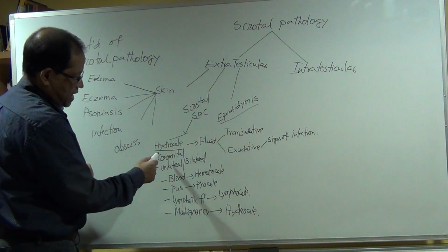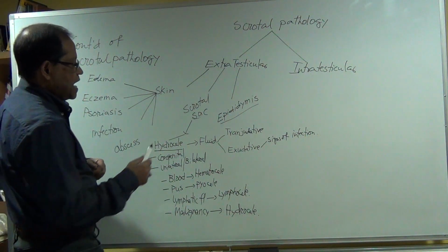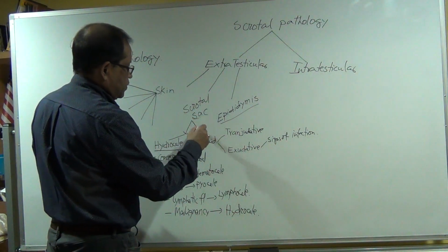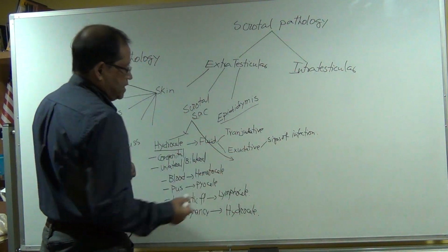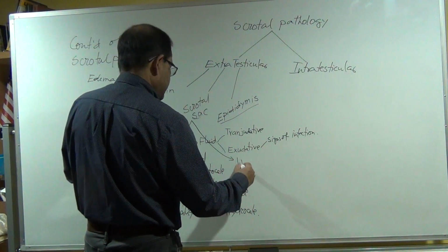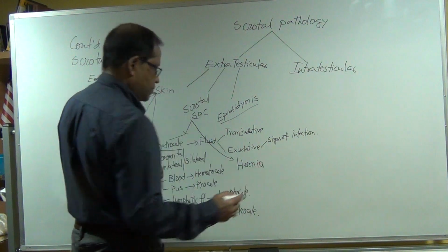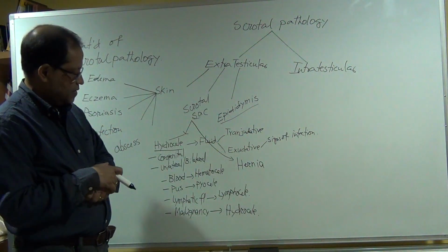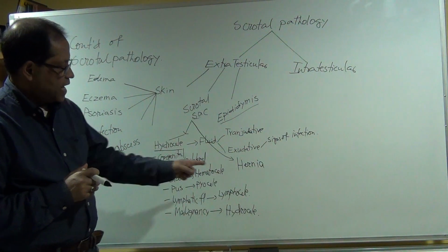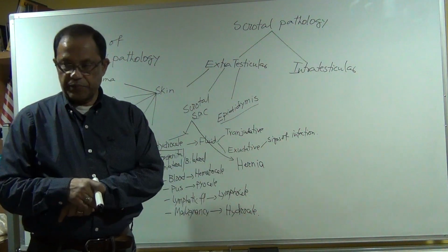Okay, in the scrotal sac, one can be hydrocele and the other, look here, would be hernia. One is hydrocele, another is hernia. And what is hernia?